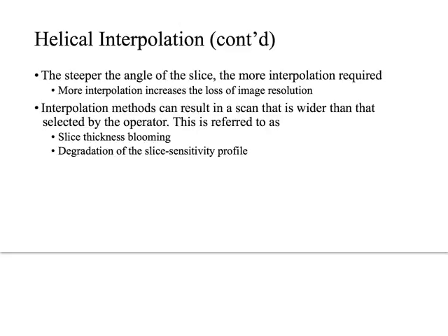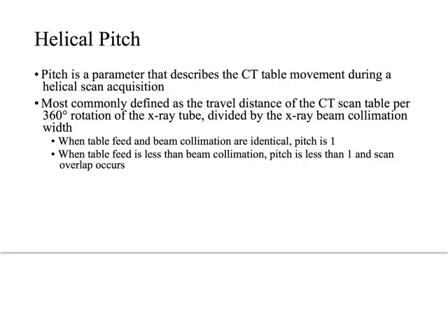Unfortunately, we don't really get a definition for pitch until the top of page 54, where she says beam pitch can be defined as table movement per rotation divided by beam width. She kind of bogs us down in some stuff here, so let's try to unpack it a little bit.